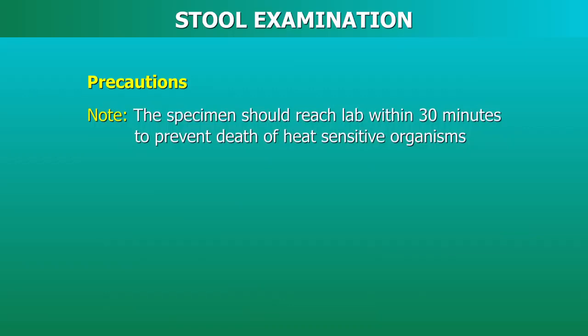Note: the specimen must reach the laboratory within 30 minutes of passing of the stool, since the motile organisms, for example Vibrio and amoebic trophozoites, are heat sensitive and can die or become unrecognizable after that period.